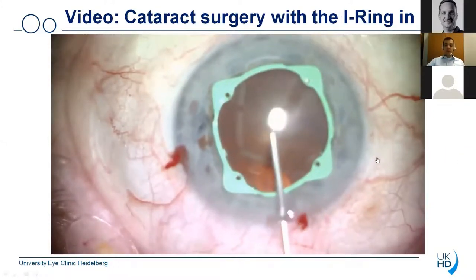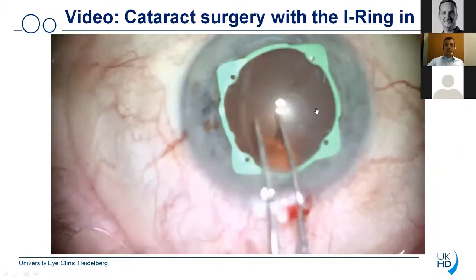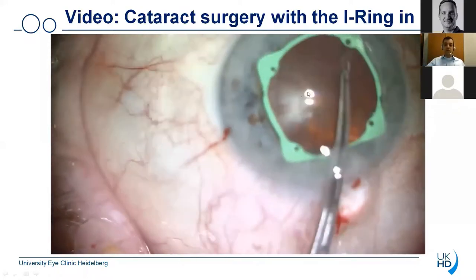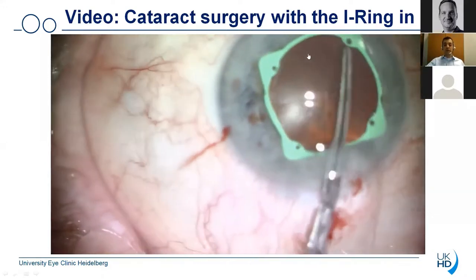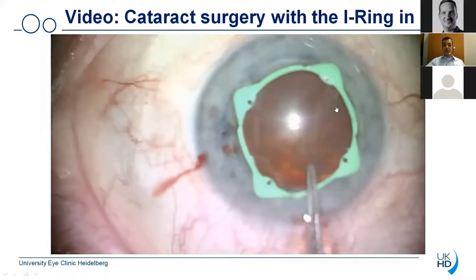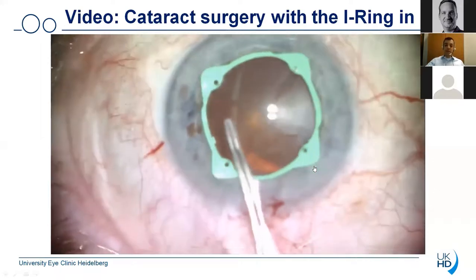Afterwards you can then continue with cataract surgery. I always recommend to re-inject viscoelastic material because during manipulation of the eye ring there is a loss of viscoelastic material in the anterior chamber, and you want to make sure that enough viscoelastic material is in the anterior chamber. You see that the pupil is uniformly round so you can very easily continue the capsulorhexis using your normal technique. You're always in full control of the capsulorhexis. You see that the field of view is so large that even in the larger axis you can always see where the capsulorhexis is going.